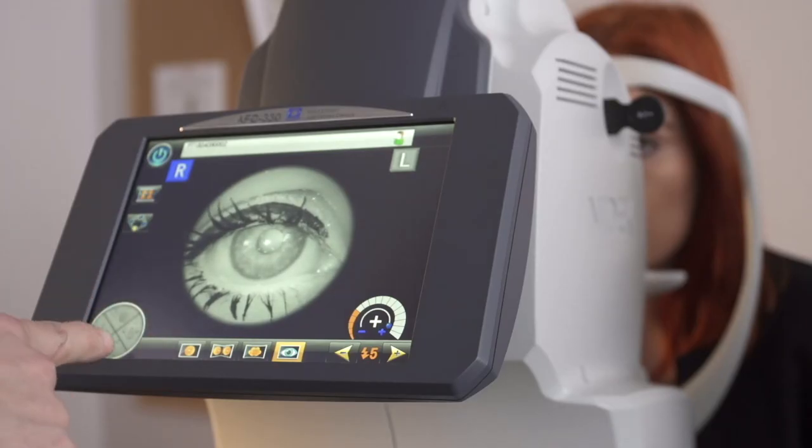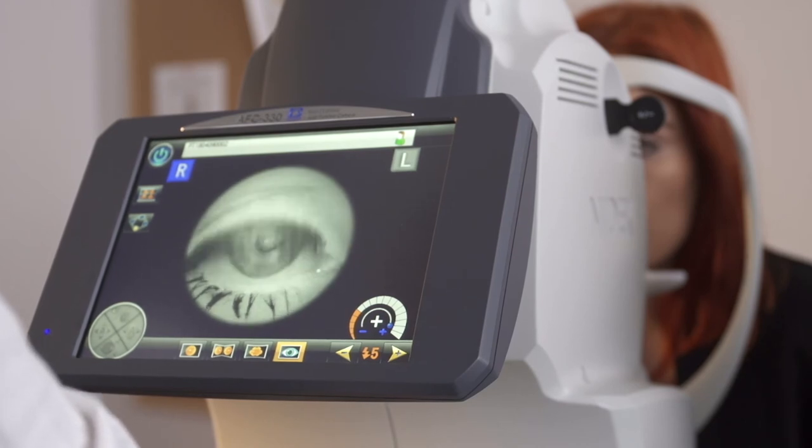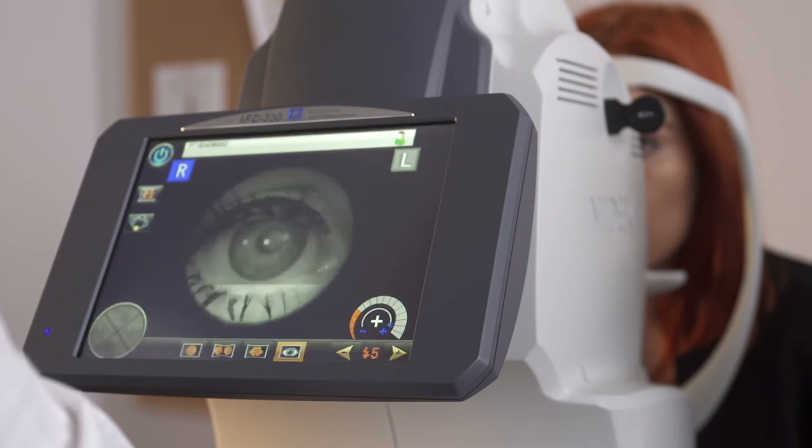In manual mode you can see none of the icons are lit. All we do is position the camera where we would like the photo, adjust the positioning to bring it into focus, and then manually press the capture button.